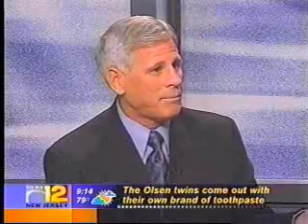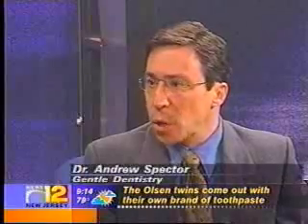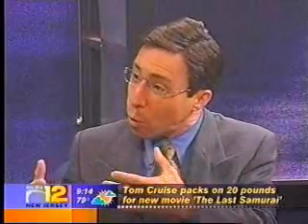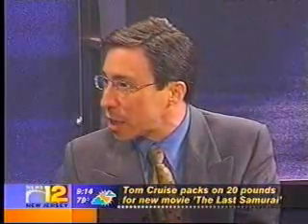I guess our patients are much happier with this. They're happier for a number of reasons. Typically, with this technology, because it is adhesive, I don't have to take away as much tooth as I would for a cap. So a lot of times I'm not doing a cap. I'm just covering 3/4 of their tooth. I'm leaving more of their healthy enamel. So it's a more conservative technique, and it conserves healthy tooth structure. I'm doing about half as many caps as I used to.